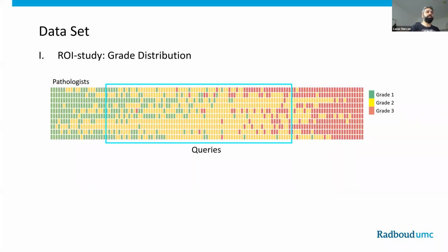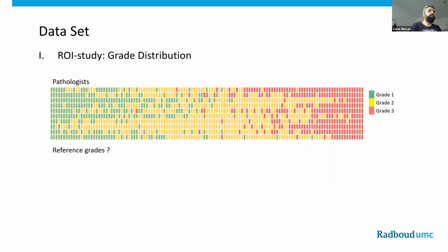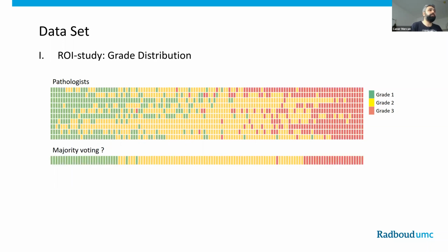On those entire whole slide images, the tumor morphology can be even more wildly heterogeneous, resulting in even higher disagreement between pathologists, basically. For these queries, we don't really have consensus grades, and it's also visibly difficult to agree, as seen here. Therefore, we obtain the reference grades from the collective knowledge of these 10 pathologists.